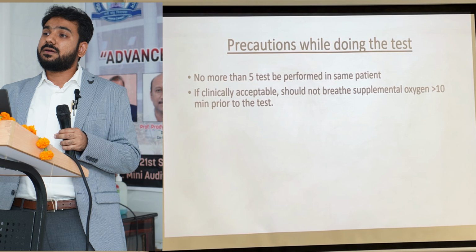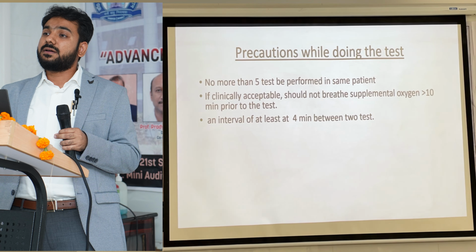If clinically acceptable, the patient should not inhale supplemental oxygen for at least 10 minutes before the test. Two tests should be performed at an interval of at least 4 minutes, so that we give time for any preformed carboxyhemoglobin to leave the system.